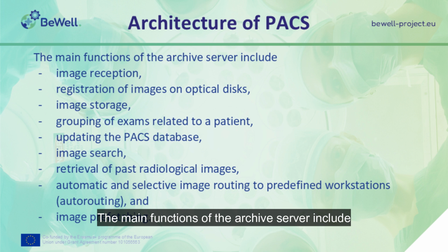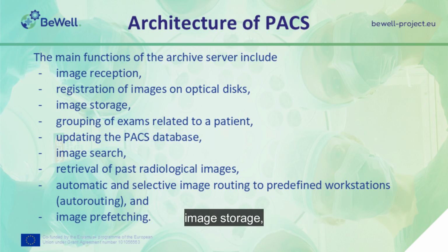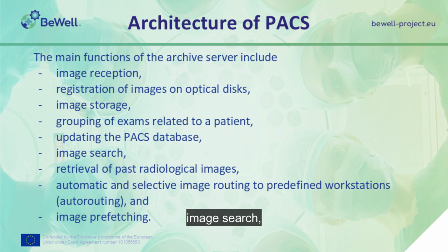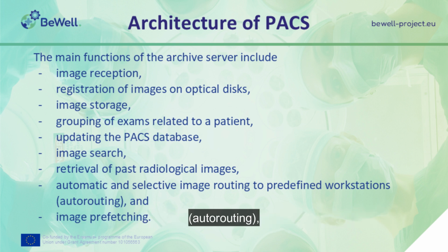The main functions of the archive server include image reception, registration of images on optical disks, image storage, grouping of exams related to a patient, updating the PACS database, image search, retrieval of past radiological images, automatic and selective image routing to predefined workstations, auto-routing, and image prefetching.